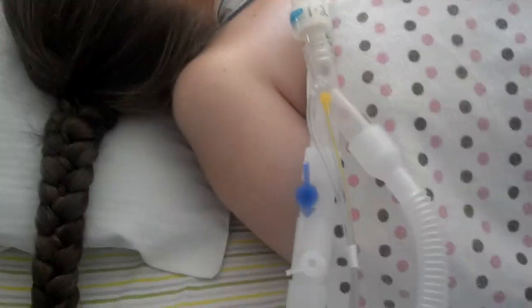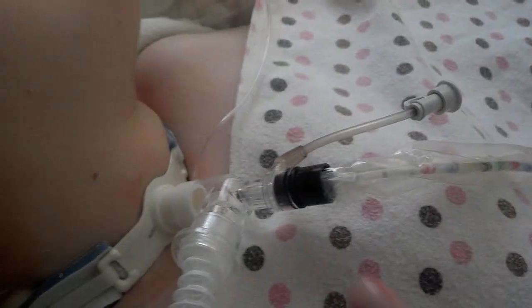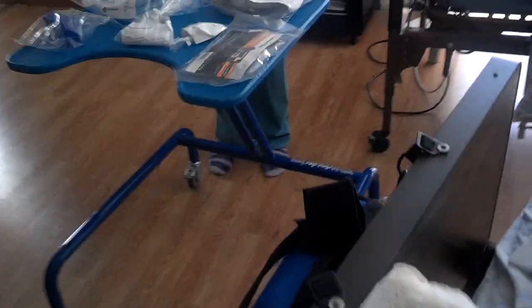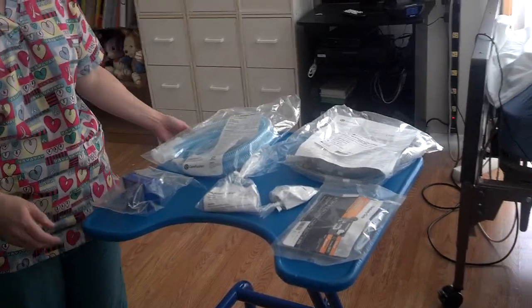Follow the tubing all the way up to Taylor. This is where you will join them eventually. The HME she's already changed today so we'll use that same one. And then this part is the Ballard. Actually, you didn't change that HME. No, Chloe can do that later.